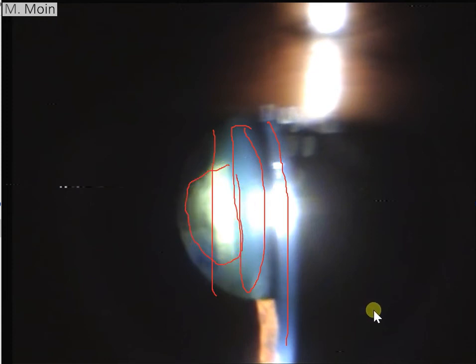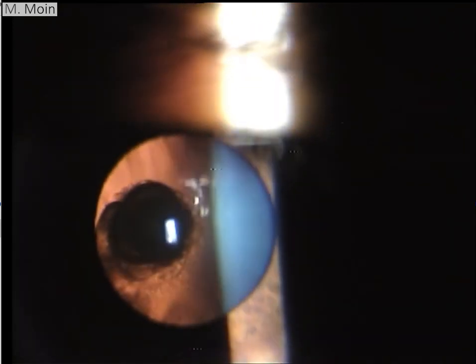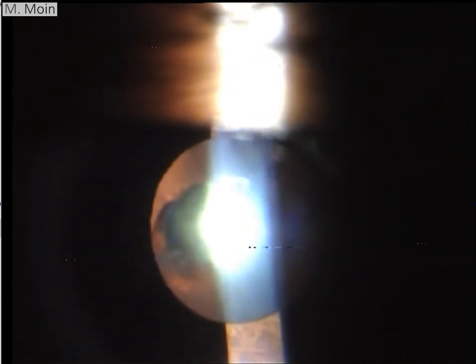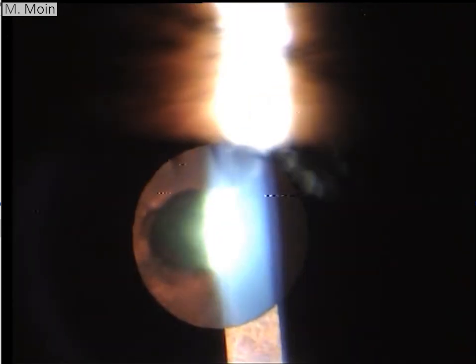So this patient had nucleus sclerosis associated with posterior polar cataract and some degree of posterior subcapsular opacity. So when you're going in you need to plan your surgery, how you're going to do that, and the most important thing is to do a limited hydro dissection and be prepared for any posterior capsular rent in this patient.